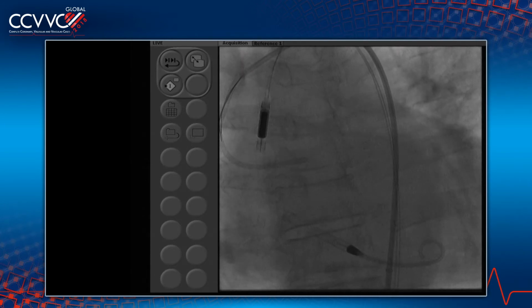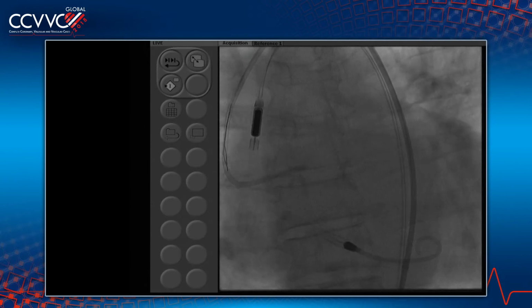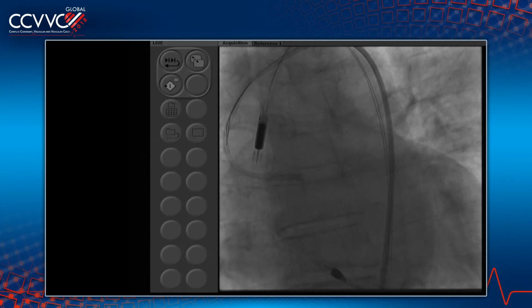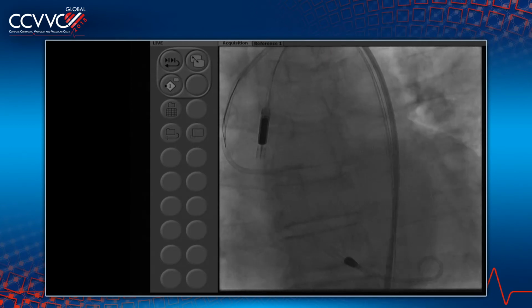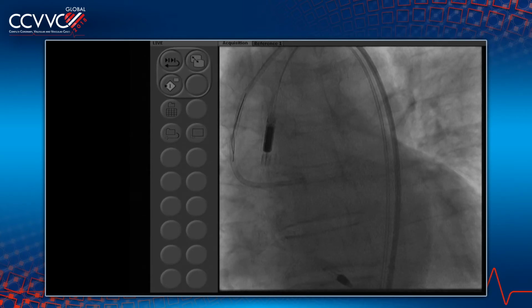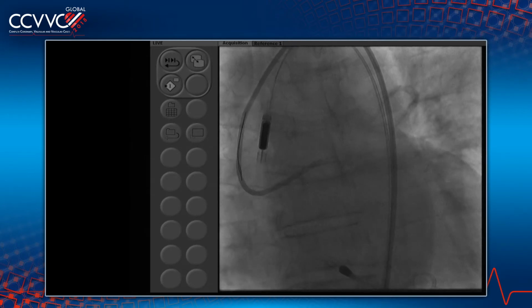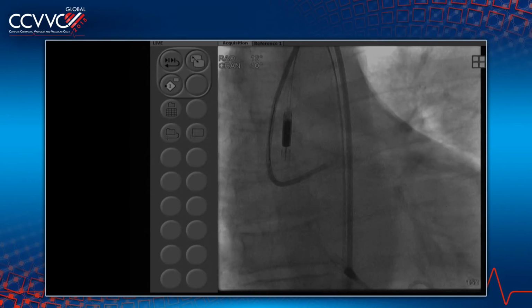Yeah. But I think I would agree also with Paul that the whole complexion changes if you're not looking at the main body of the LAD and left main as being areas you have to intervene on. Now you're looking at a side branch diagonal, a major marginal, which is significant, and then a right that can be staged or done at the same time, depending upon the amount of time and effort it takes. So your plan now is to treat the diagonal and probably, are you going to stent across the left main?